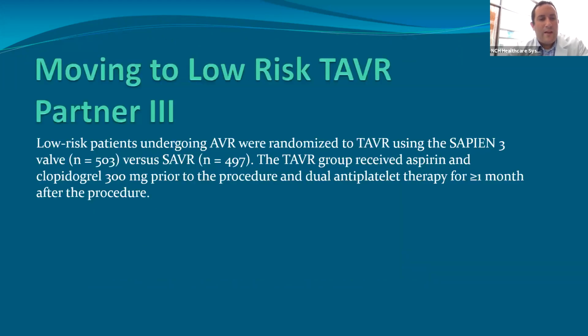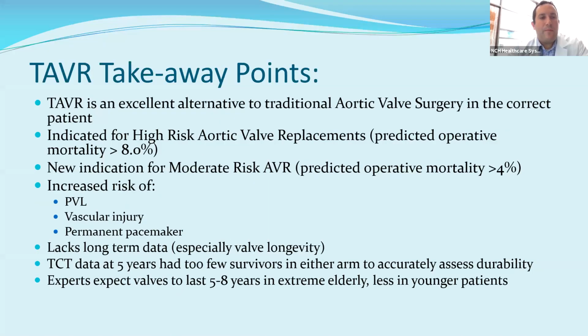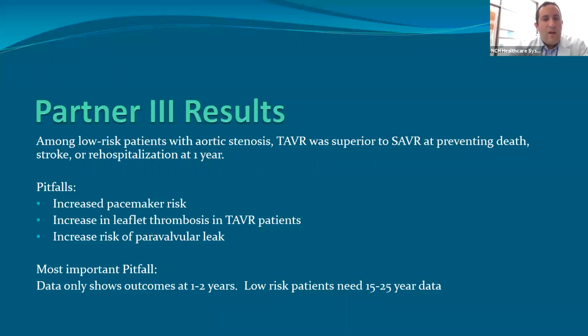And to go through quickly, I can just say that we went through all of this similar study, similar breakdown, and we showed that patients did very well with intermediate risk as well. It was equivocal outcomes. Takeaway point, we then repeated this with the Partner 3 trial, which was the low-risk study. Similar trial, similar ideas, low-risk patients. It basically opened it up to all comers.